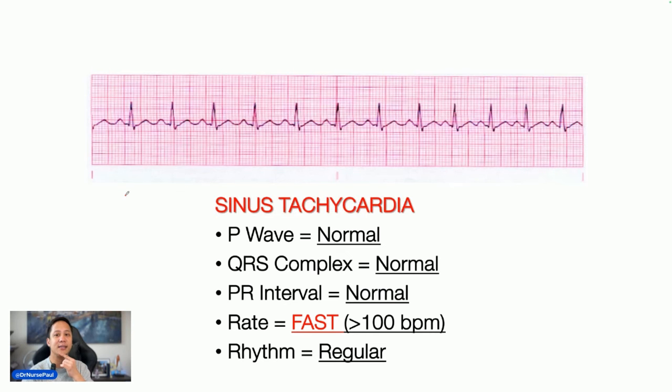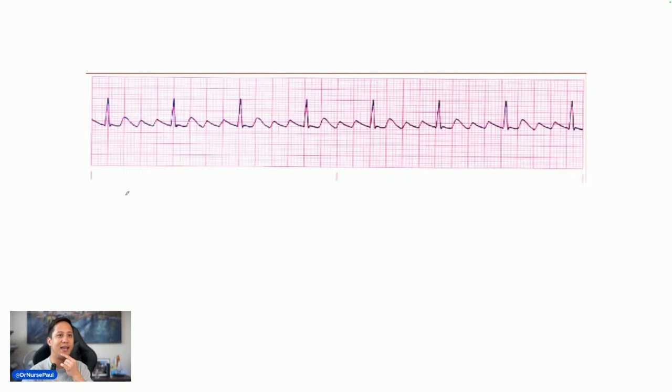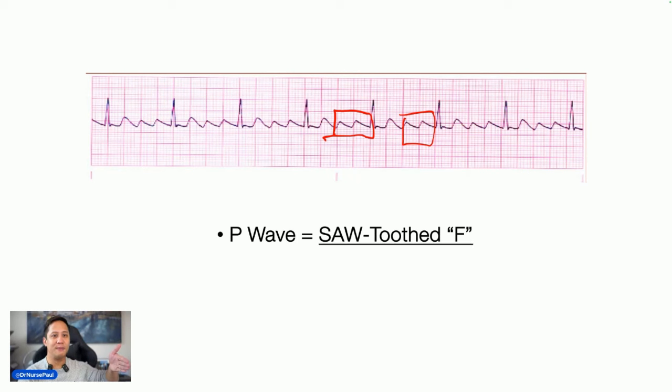Alrighty, next. All right, let's now go to this. Ta-da! Uh-oh. Do we see a normal P wave? Yes or no? Does that look like a normal P wave to you, guys? No. Does that look like a sawtooth pattern? Like a saw, the saw that we used to chop wood? Yes, that's not a normal P wave. That looks like a sawtooth pattern to me, right?